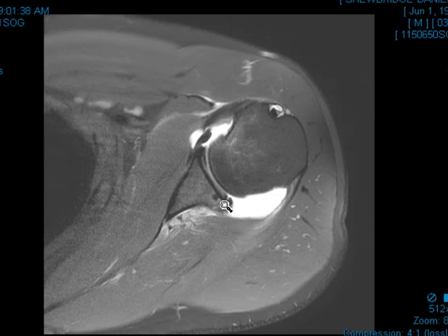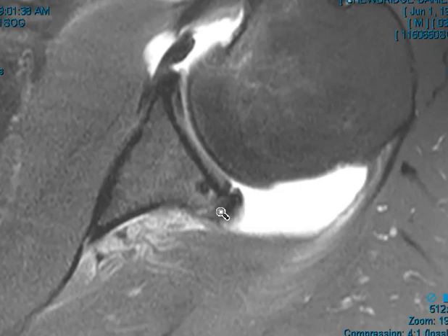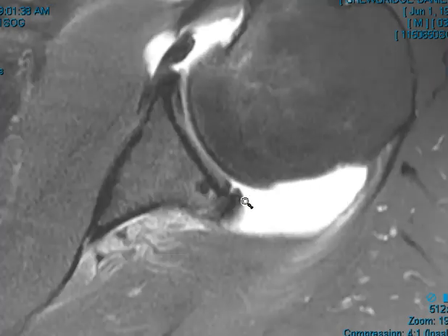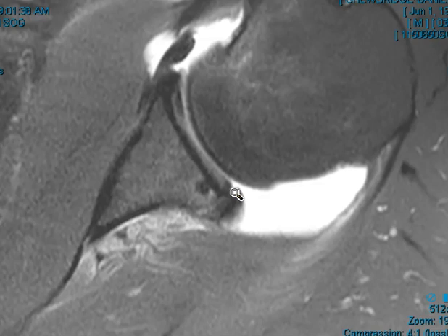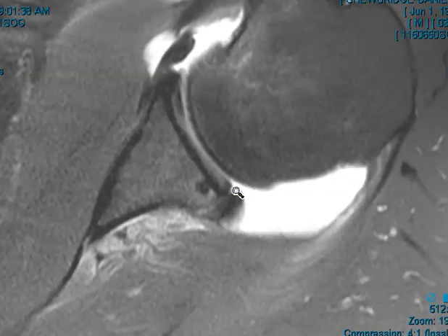In the back, we have a corresponding injury here. Let me zoom that on up. The back of the glenoid is thick and irregular here — instead of being nice and clean, it's kind of thick and foggy. This is a chronic tear of that posterior joint capsule where it attaches to the bone. This has been torn off and it's thickened — it has this chronic periosteal thickening and tear of the joint capsule, and also maybe the labrum here. The labrum is a little black wedge that goes around the rim. In the front it looks nice and clean, but in the back it looks like there's a little vertical band of brightness, which is fluid going in. This looks like a tear of that posterior capsulolabral complex — the joint capsule and labrum where they blend together are torn right there.